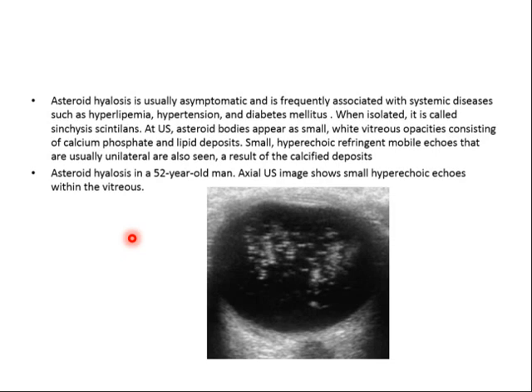Nice. So this is all asymptomatic? Yes, but it is significant because it may cause posterior vitreous detachment. Yes. And vitrectomy may be done in this case.